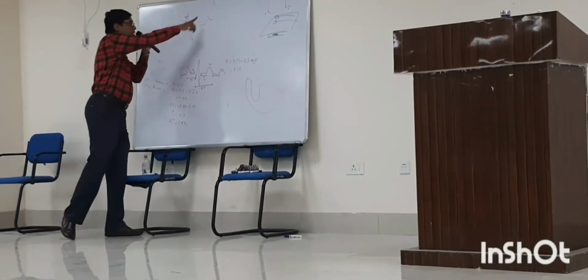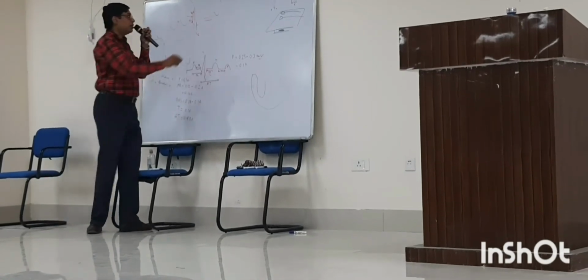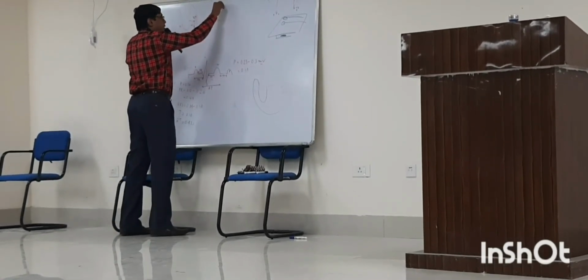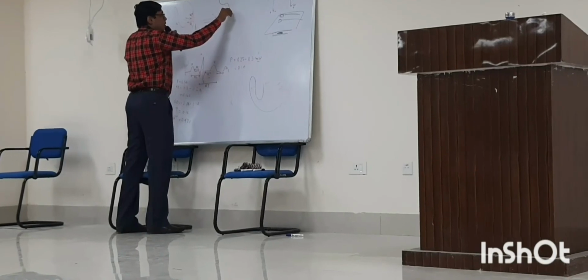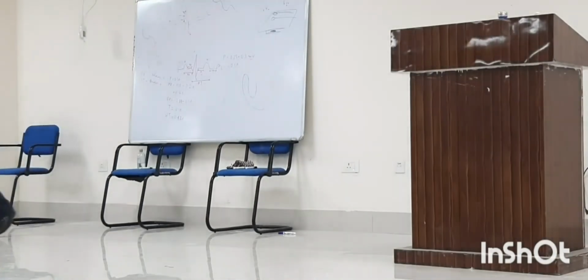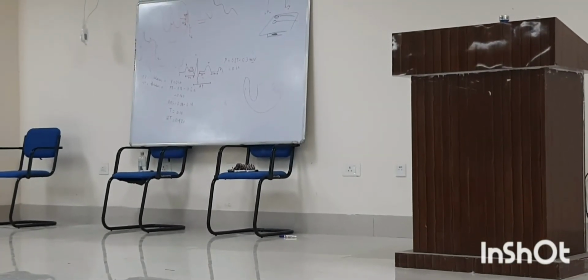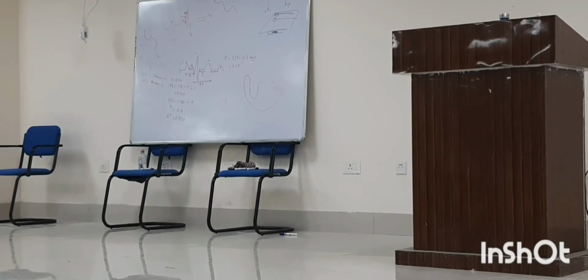So, it doesn't touch the baseline. Repolarization started from here. So, it is called ST elevation, what is found in myocardial infarction or heart attack.